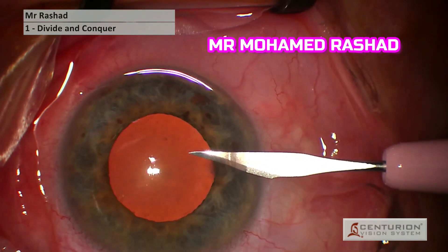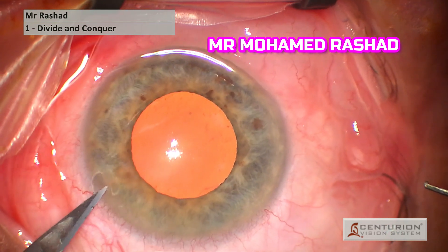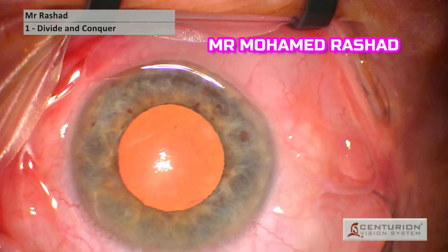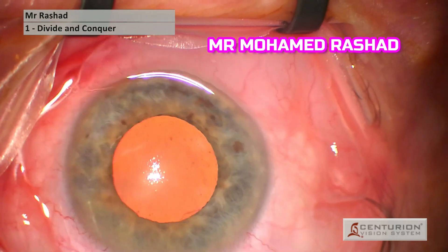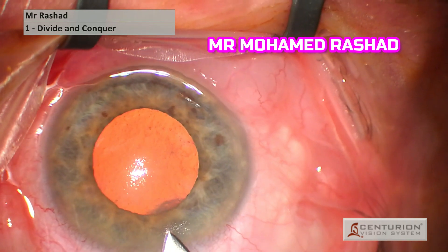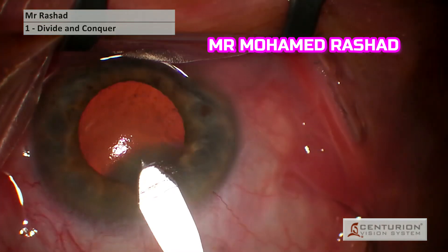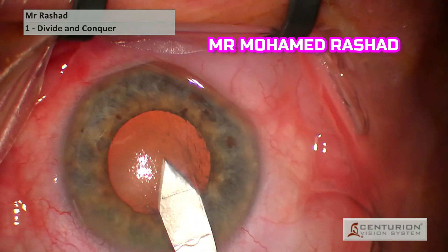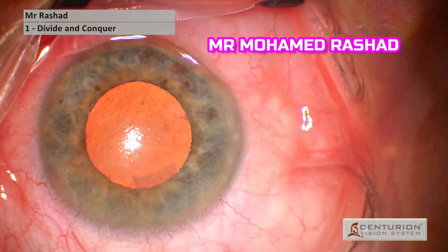This is case number two with the same technique of anterior wounds, but this case is different because the anterior chamber is very shallow, about 2.2 millimeters. We do the same technique of anterior biplanar incisions. You will see I go with the keratome in the same long tunnel — take care because the AC is shallow — and the tunnel still reaches the edge of the pupil to avoid iris prolapse.